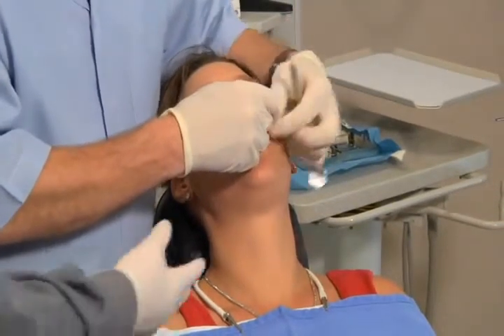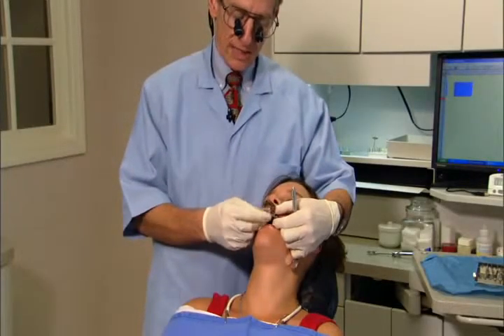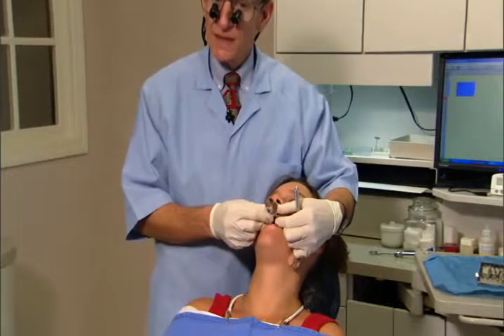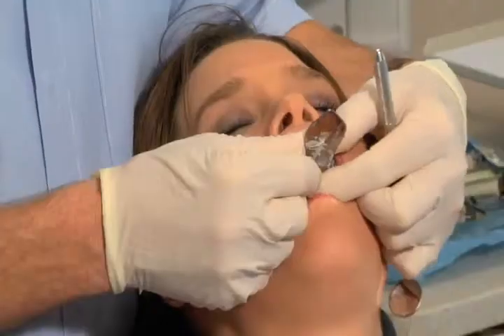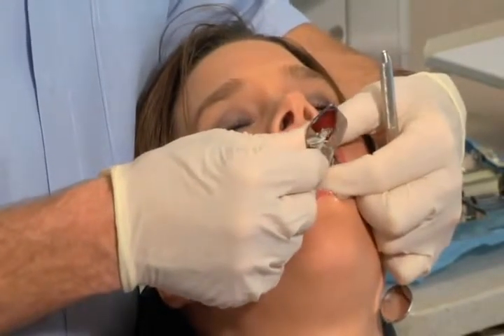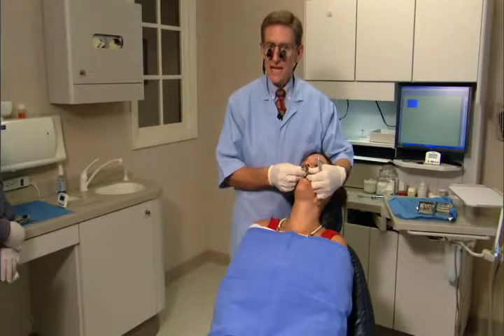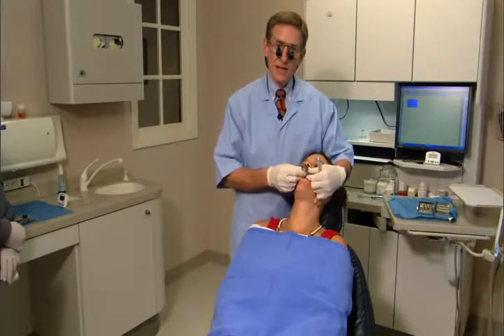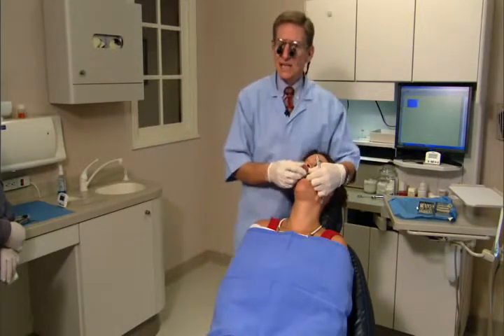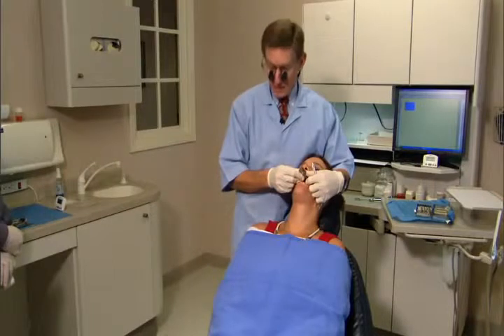I'm checking that the hole in the tray handle is lined up with Denise's midline. If I need to move it slightly, the alginate is soft enough to allow that. I've pulled her cheeks up and out, trimming that impression a bit. Notice that I'm very relaxed — standing upright, shoulders relaxed, elbows down. A patient feels the relaxed effort you're giving and will relax themselves.